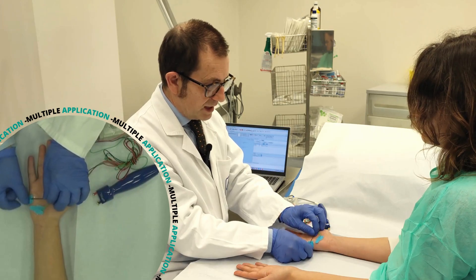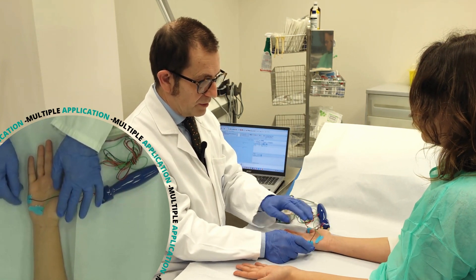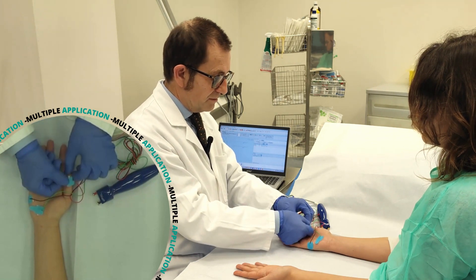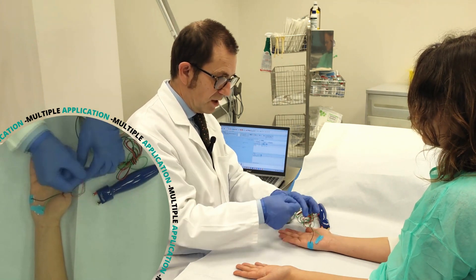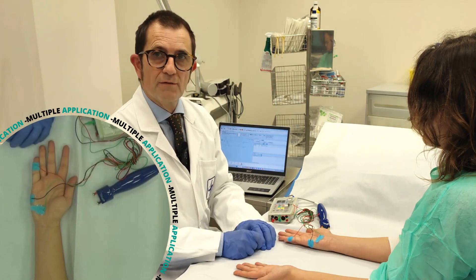As you can see, I can move from a muscle of the median nerve to a muscle of the ulnar nerve without any problem, any dirt, and the contact remains perfect.